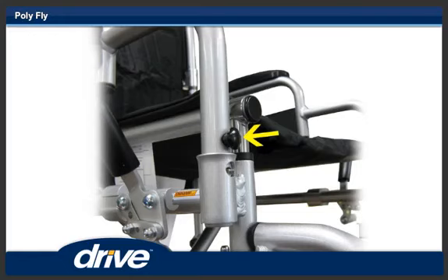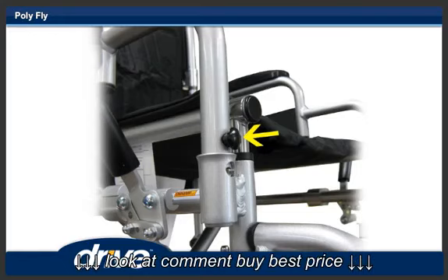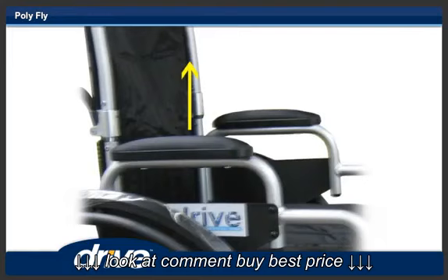Step 14. To remove the armrest, depress the arm release button and pull the armrest straight up.